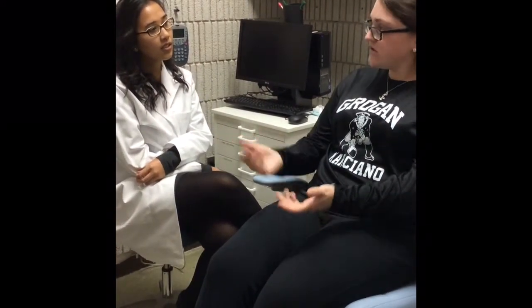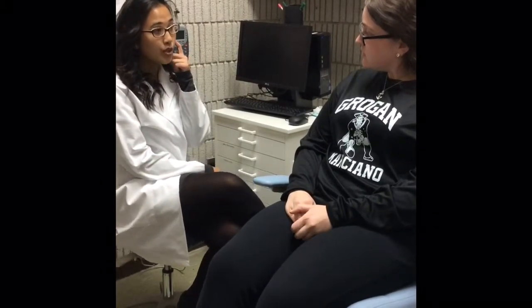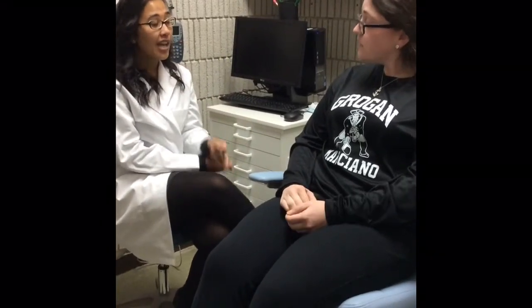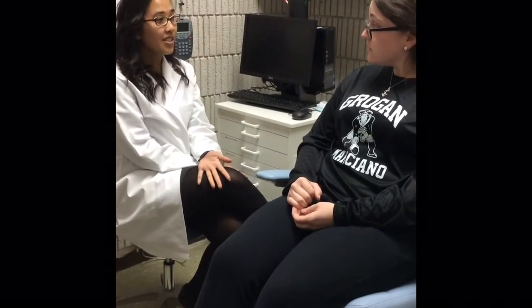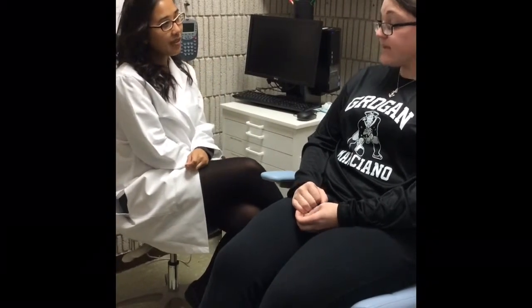Okay, well, why couldn't we just use the regular 2D imaging? Well, you can use 2D imaging to see your last molars, which are your wisdom teeth there. But with 3D imaging, you can see overall what's going on. If there's any impaction that can cause pain in your mouth, and we don't want that to happen. Yeah. And there can be bone resorption that will mess up the entire teeth. Okay. And with the 3D imaging, we can tell if we need to extract your teeth or not. Okay, that sounds good, yeah. Okay, let's get started. Thank you.